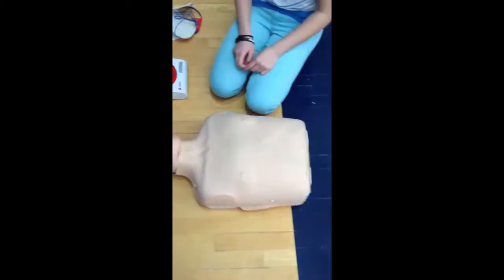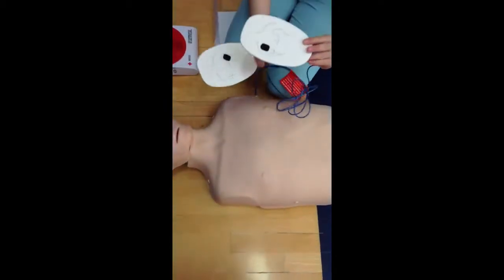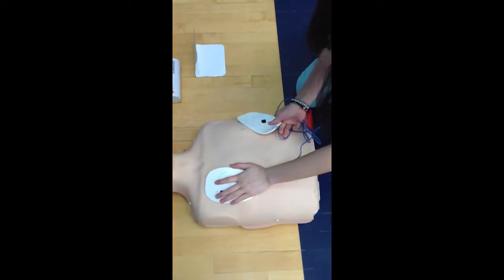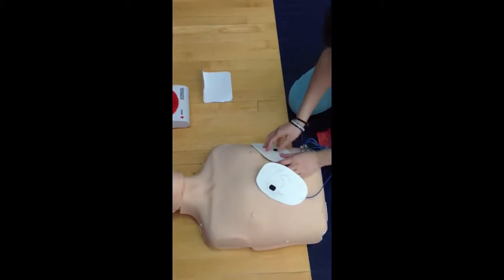Then, looking closer at the pads, there are 2 pads and they go on different sections of the chest. One will go on the upper area of the chest, and then one will go below on the other side. This is a training device, so the pads aren't very sticky, but using a real AED, the pads will stick really, really well. Even if the person is conscious, leave the pads on so the AED can analyze the heart rhythm. So if anything bad happens again, it'll save the person.